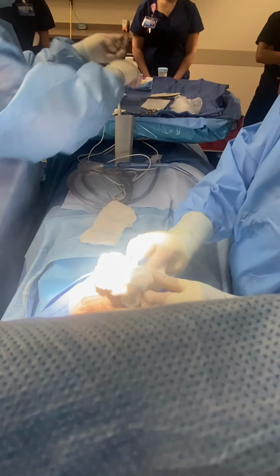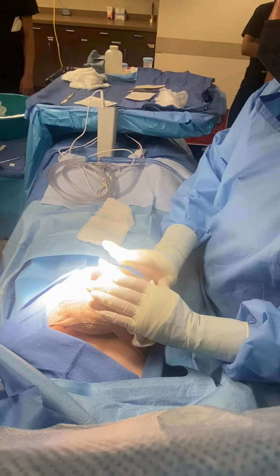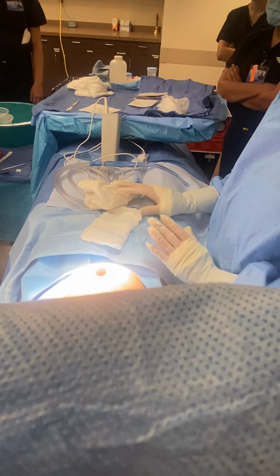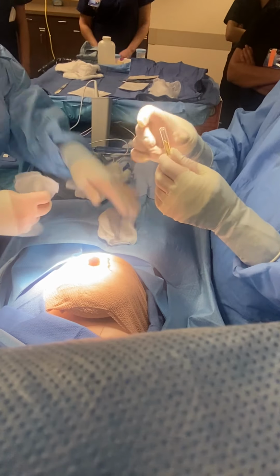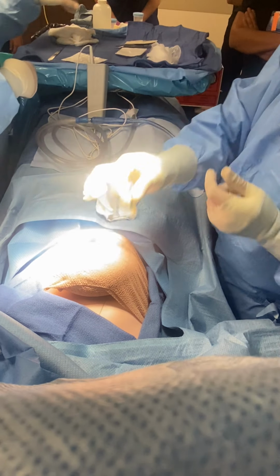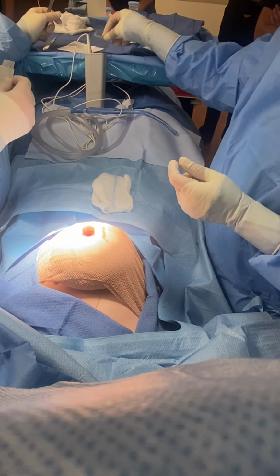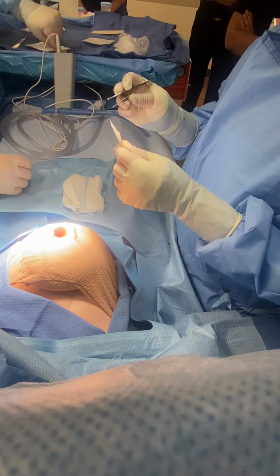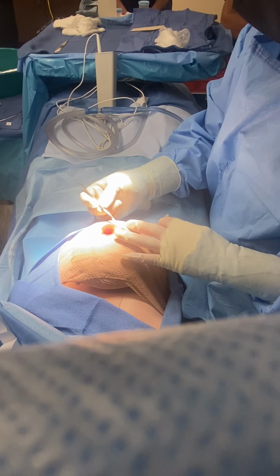Floppy, wet, dry, floppy, dry. Would you like a floppy Joe next? Do you like floppy Joes? I do. Mastisol, yes. Crack. These normally are kind of the same thing. You would just squeeze and crack, and then the fluid comes to the very tip. These are amazing, and I love the way they smell. They do smell good, especially when it's a poopy case. And you have an awesome circulator. They'll put it on your mask.